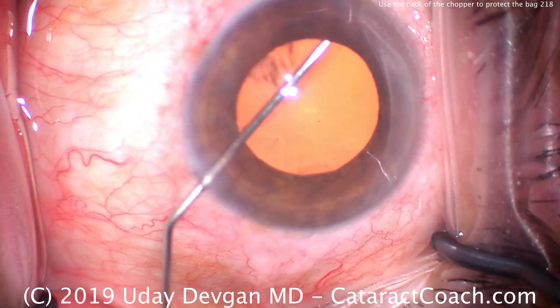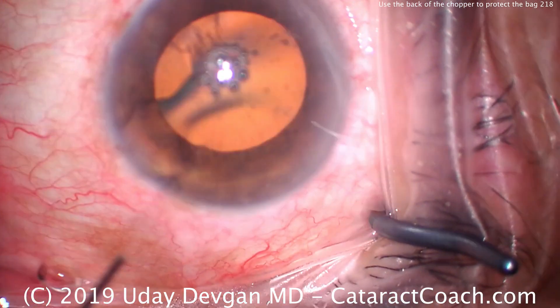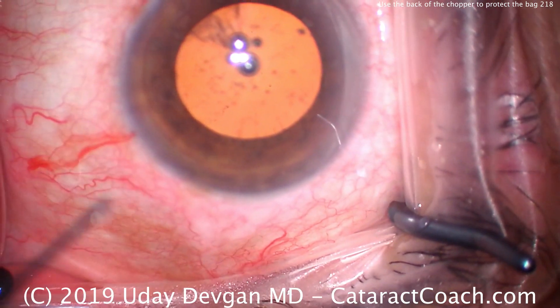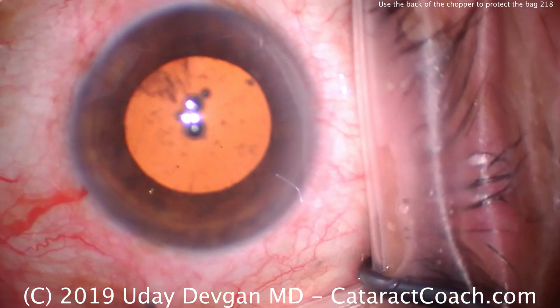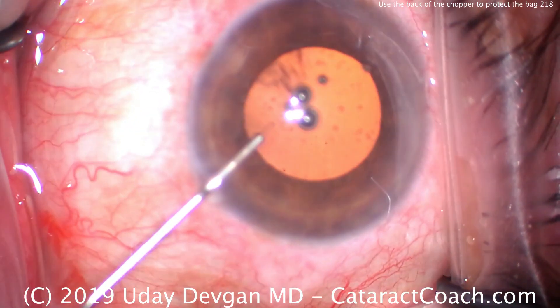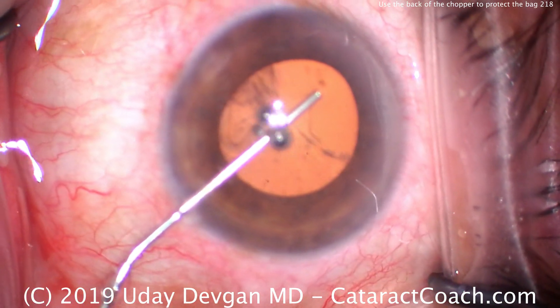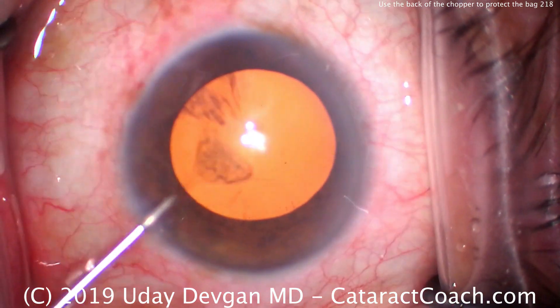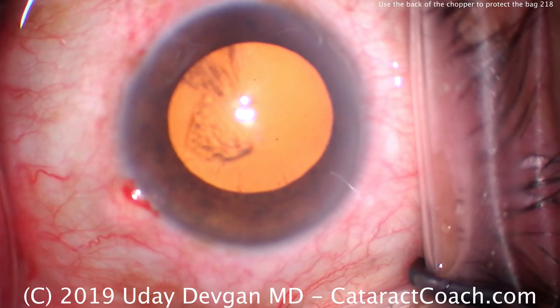This is a patient who has a smaller anterior segment and a shallower anterior chamber — a hyperopic patient. We're going to put in a higher power lens, a 27 diopter lens, so we can tell the patient is certainly hyperopic. We're filling the anterior chamber here with viscoelastic; we try to get some deepening of the anterior chamber, which also helps dilate the pupil a little bit.